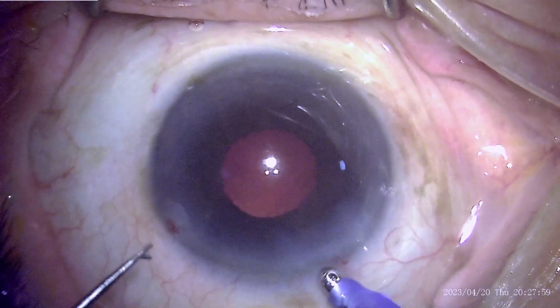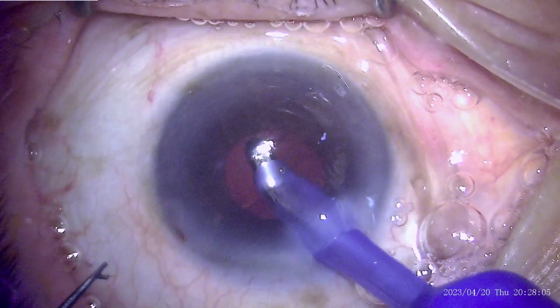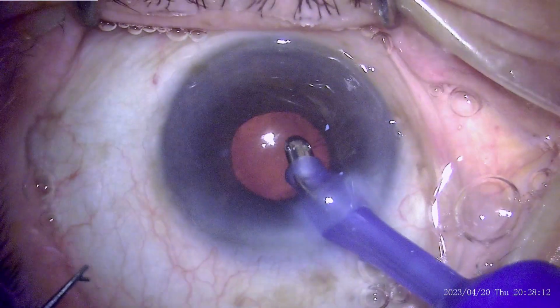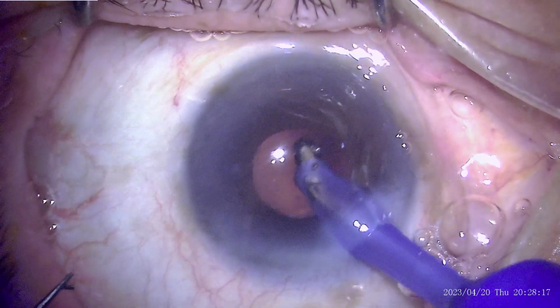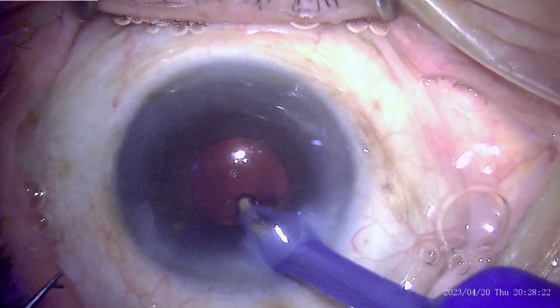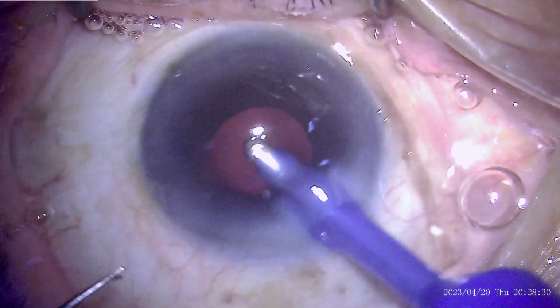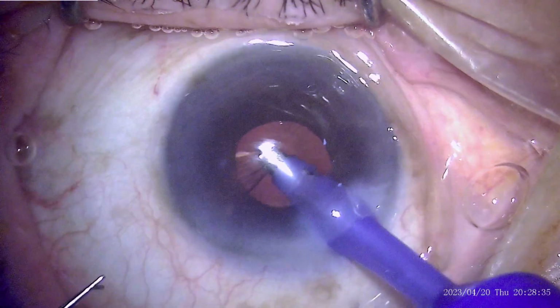I am ready with my Y-shaped dialer, and this is used to expose the tissue behind the iris by retracting the iris, pushing or pulling it. But here I was able to make out the wisps of cortical matter just behind the pupillary border, so I have not used this tool and just kept on engaging the fibers of the lens which are visible just behind the pupil, keeping track of all the quadrants which I have finished, so that I can sweep all the quadrants and in none of the quadrants is the cortex left behind.